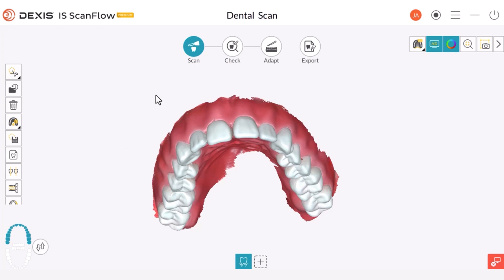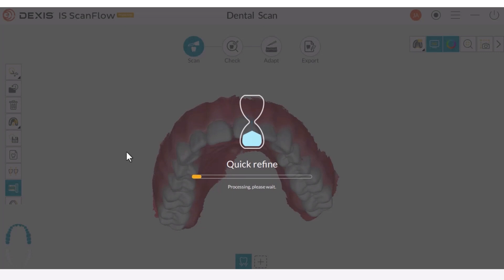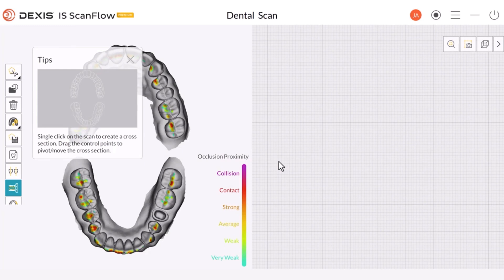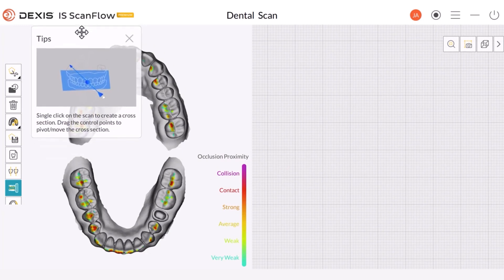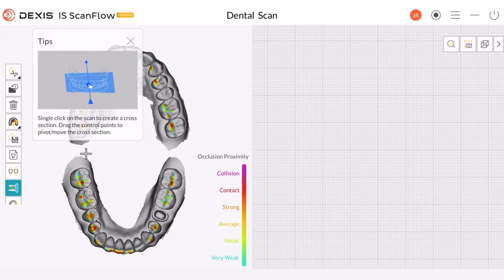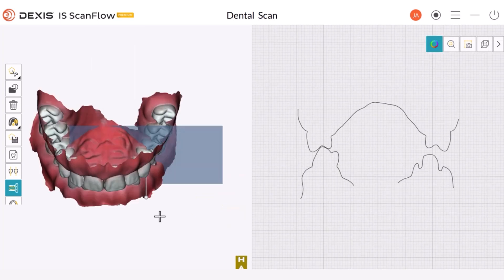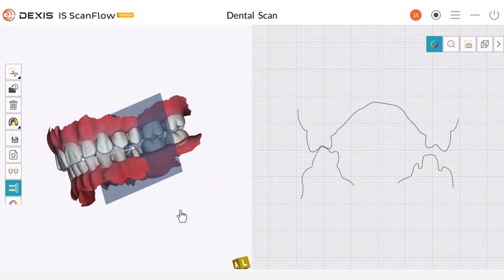You can use the Occlusion Check tool when you are in the Scan mode or the Check mode by selecting this button. Once you engage this option while in the Scan mode, the software will perform a quick refinement to provide you with a 2D rendering. When the software finishes the refinement, this window will appear presenting the same bite information. With the Occlusion Check tool engaged, we can place the crosshair on the top of a prep, which creates a 2D slice on the 3D arch.